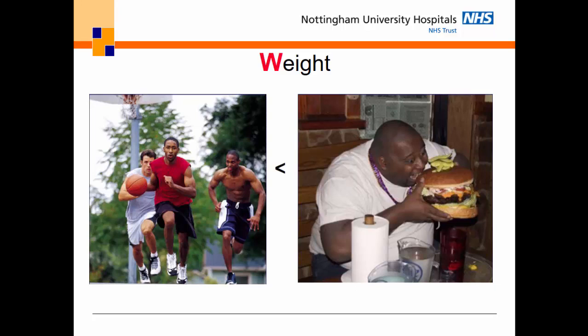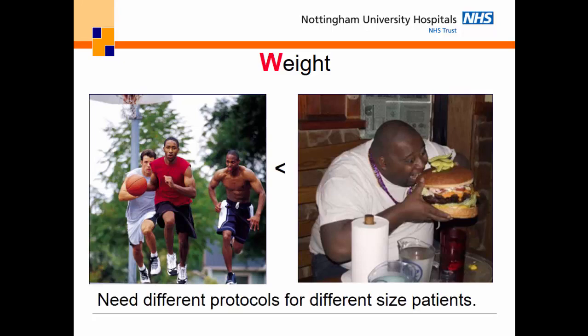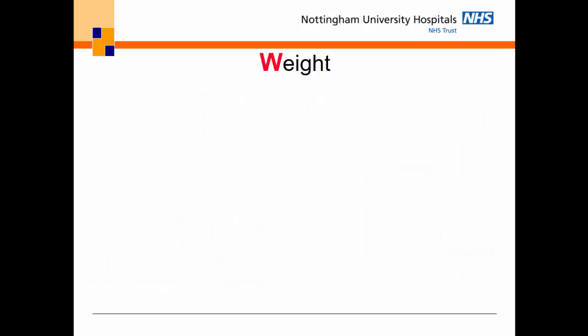However, if your patients are on the very large size, you may need to think about slightly different protocols for them to make sure that you scan them effectively. Okay. So Tara mentioned earlier about the changes in kVs and things like that. You've got to have protocols that match the weights that you're getting. Okay, so you might need different protocols for different patient sizes.